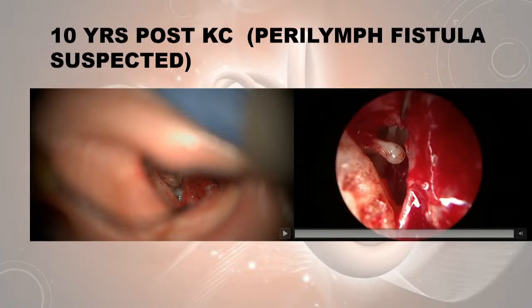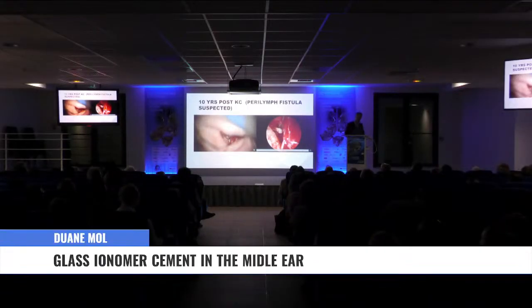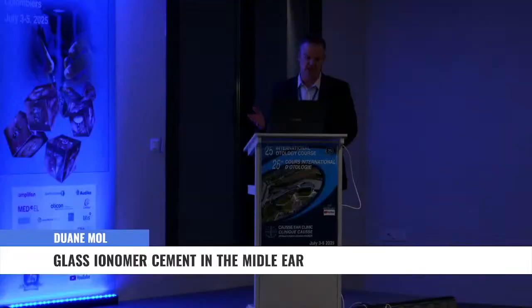So you can see that's what it looks like 10 years later. It hasn't changed, hasn't moved, looks great. This wasn't a cholesteatoma though, so it wasn't badly eroded or anything like that. Let's move on to the next slide.